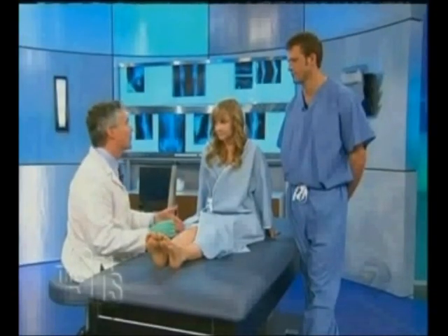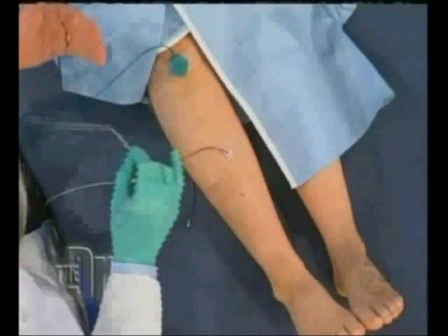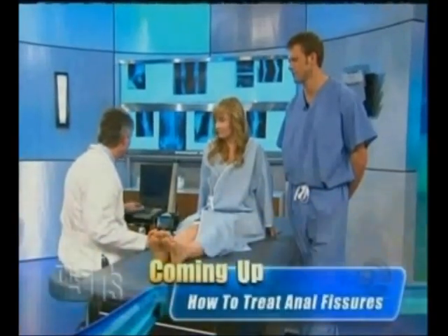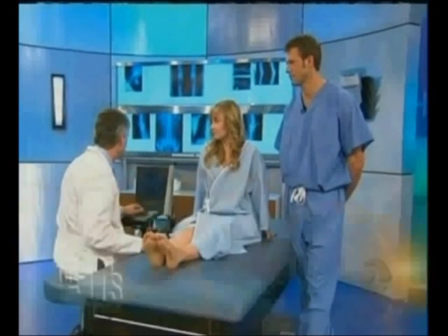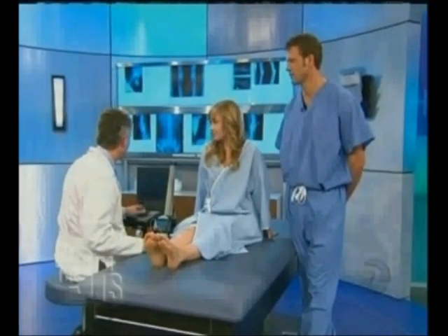There are two parts to the exam. The first is the pin stick, or the EMG. The second is what's called nerve conduction studies, where I actually stimulate a nerve at one point and pick up the impulse downstream to see how fast and how efficiently the nerve conducts. I'm going to go back to one of the screens where I saved Amanda's information from earlier today, and it clearly shows exactly what her problem is.